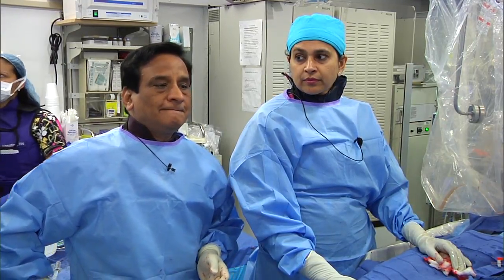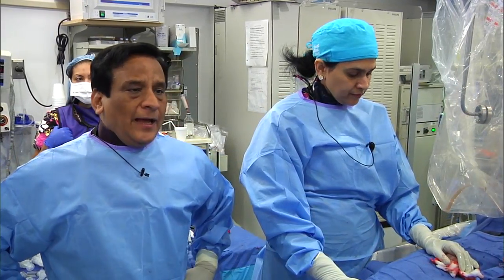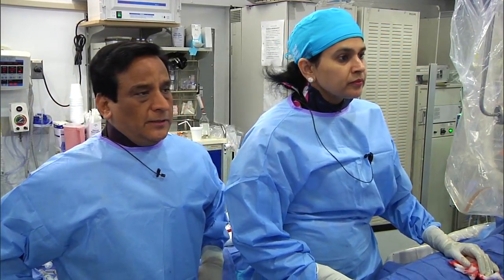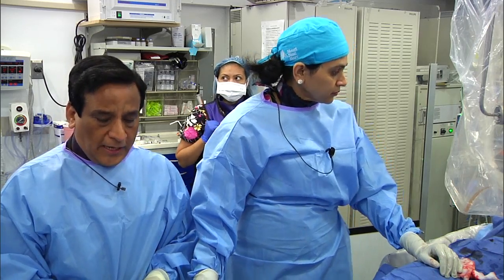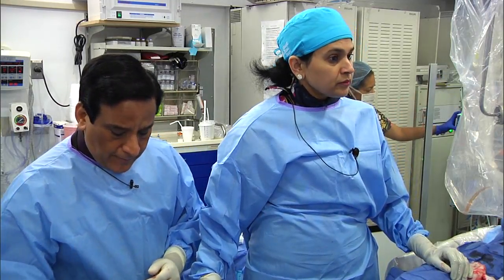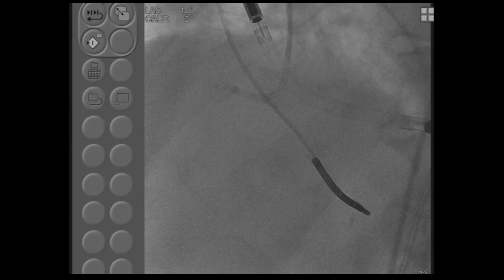Samin, there was a practice in the past to guide it with the use of also putting in a Swan. No need absolutely now? Well, in the trial, but I think in some cases where patient really have a bad hemodynamics, hypotension, do you think it's a mitral regurgitation, patient EDP is high, guiding with the Swan will be reasonable, but not routinely. So if we take out of the PROTECT 2 trial, which required putting a right heart cath, in our day-to-day life, we use a right heart cath in maybe about 1/4 of cases. It's not routine anymore. So if the access is not an issue, age is not any barrier?